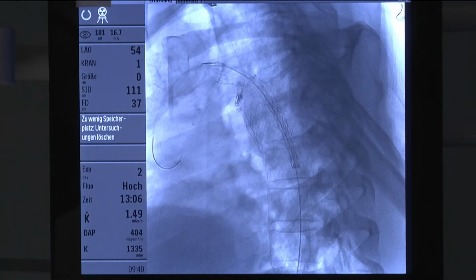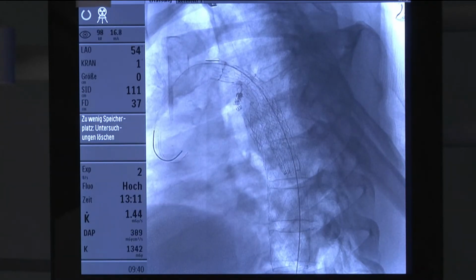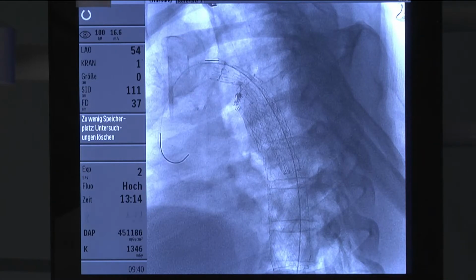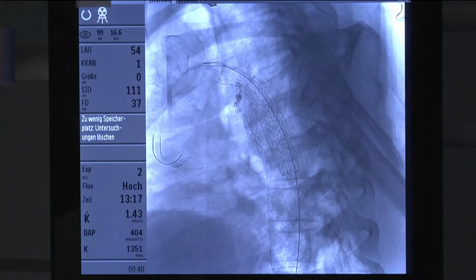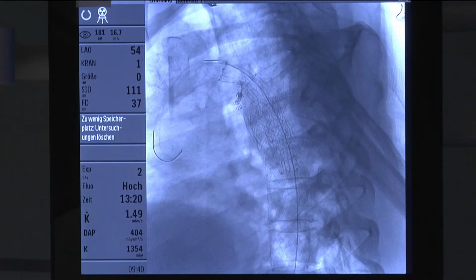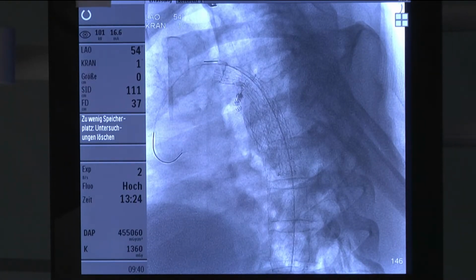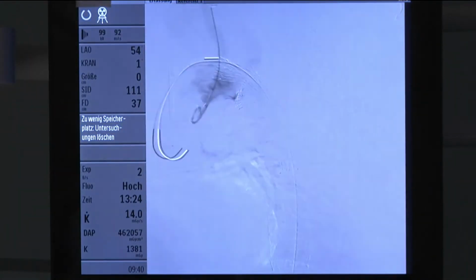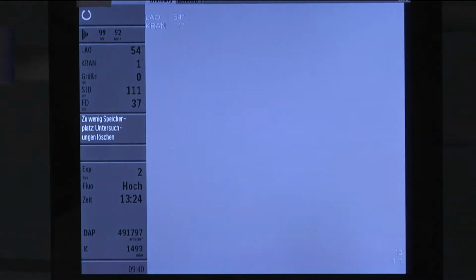So we're opening to half the diameter. Now we're going to use angulation control to tilt this in the aortic curvature. Okay, we're going to now do an angiography at this position. Apnea, please. I think that our positioning is very good.